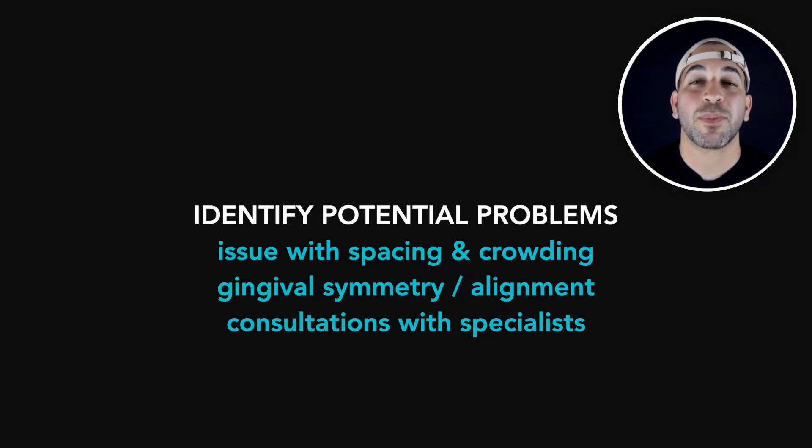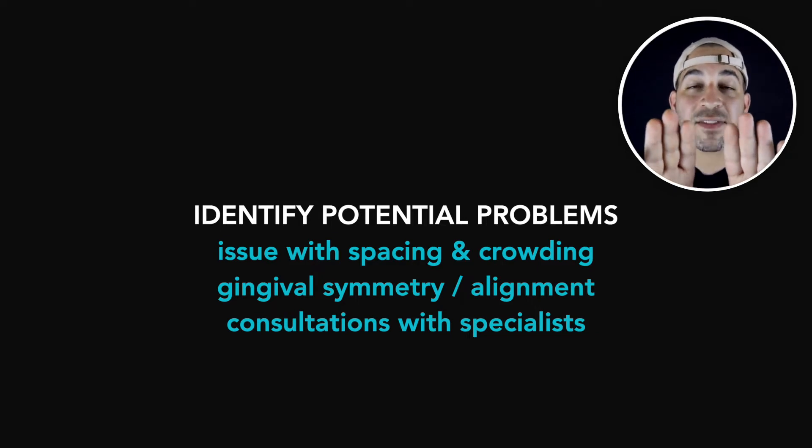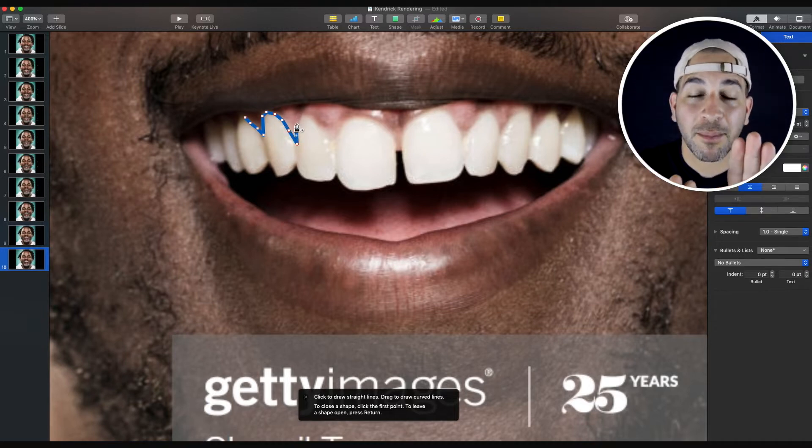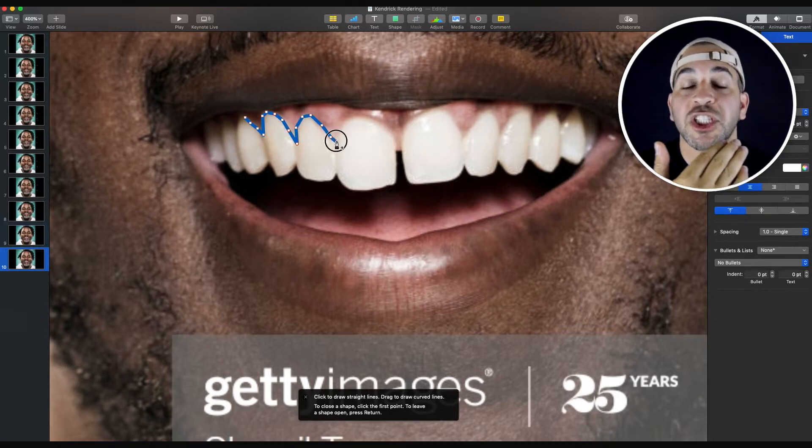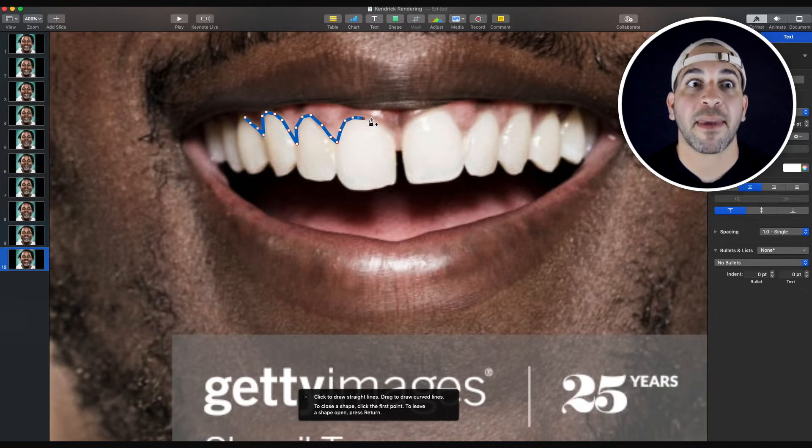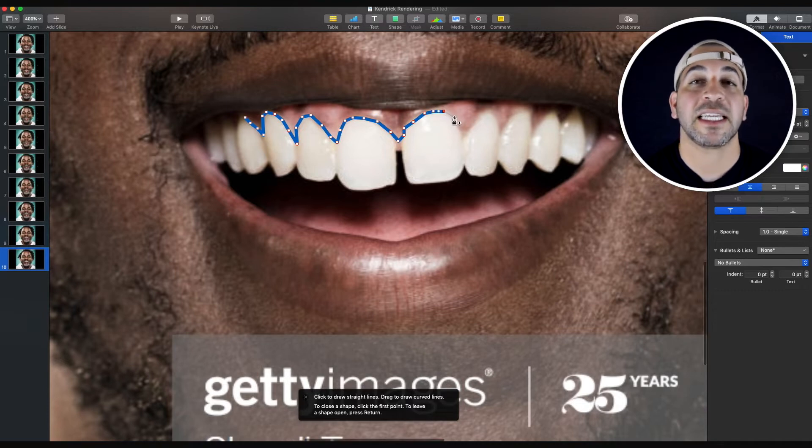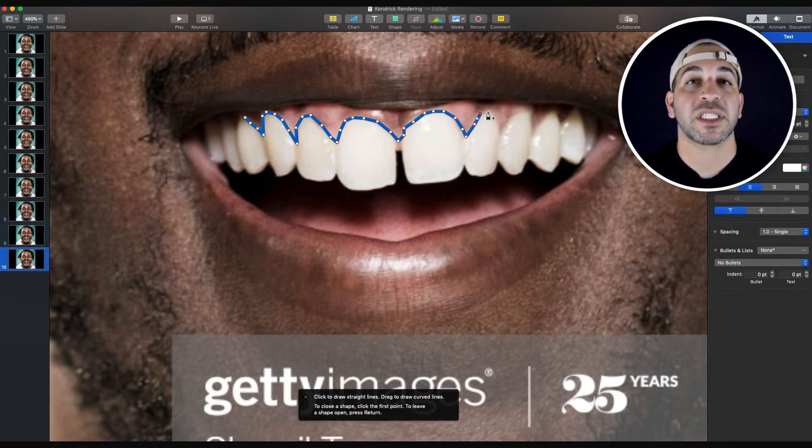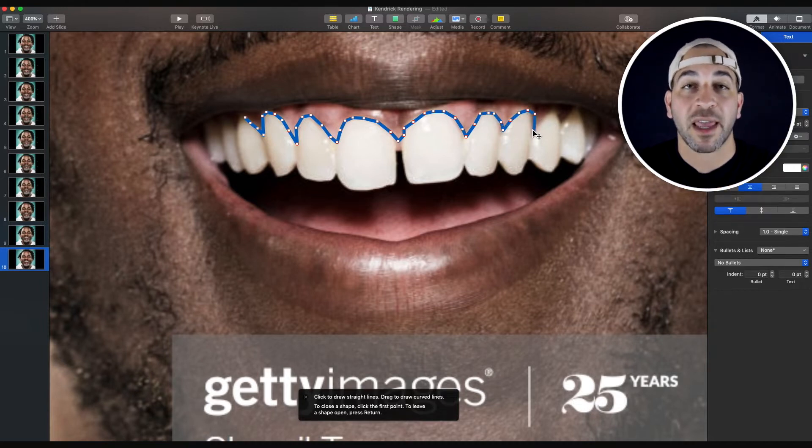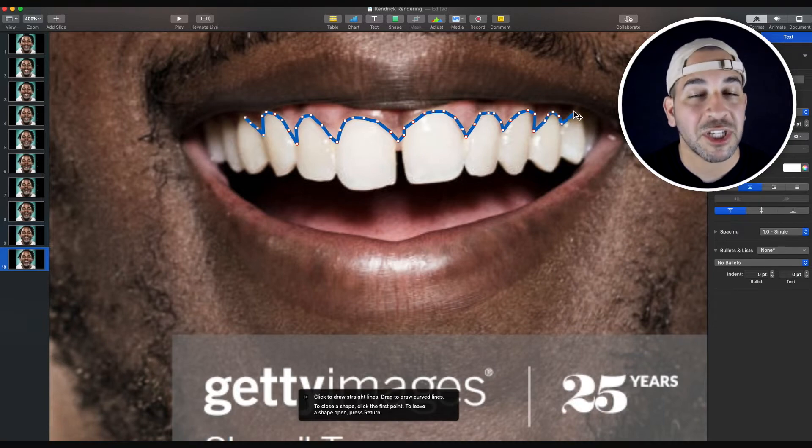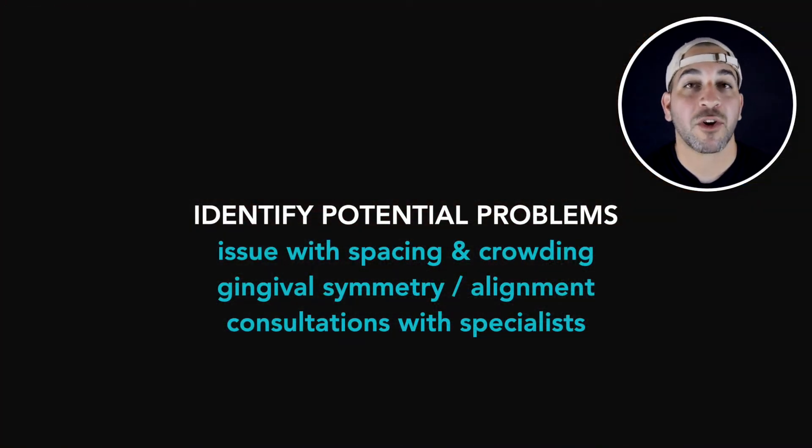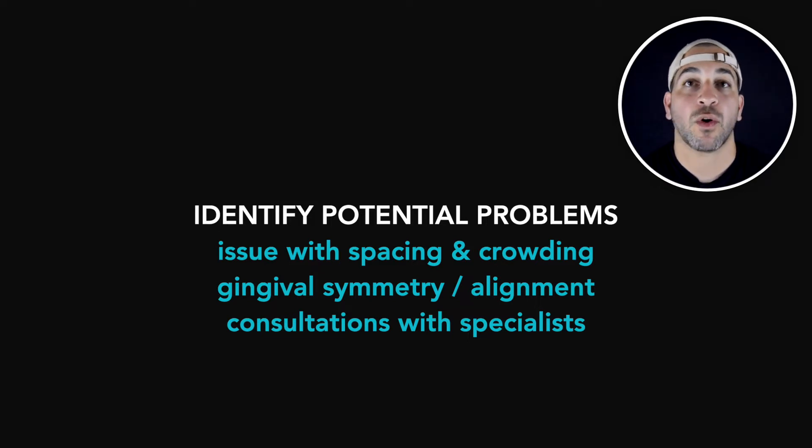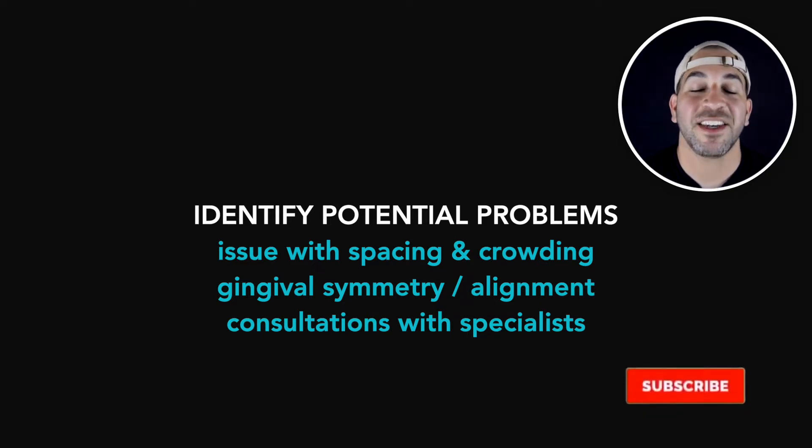You can also place the veneers digitally over the gums in a way that gives them a gum lift, and you can also show them what's possible if you don't do a gum lift. So this is really helpful for people that have gingival asymmetry, where they may need to do intrusion therapy at the orthodontic, or they may have to do crown lengthening to get the ideal result. But you want to present all options to your patients, and by designing the smile digitally, you can show them the different options, and then they can make a better decision moving forward. This will allow you to identify whether your patients need to go see a periodontist or maybe an oral surgeon for implant placement before getting started with the veneer procedure.